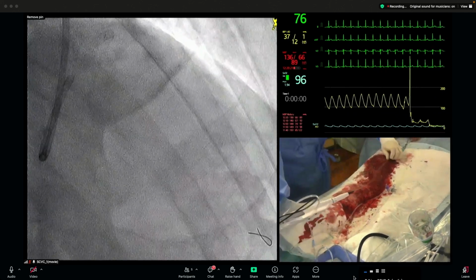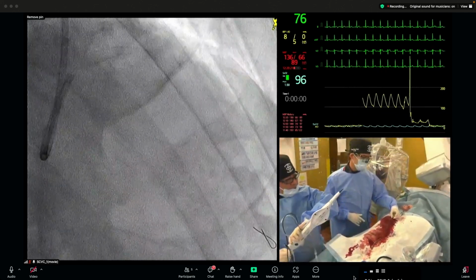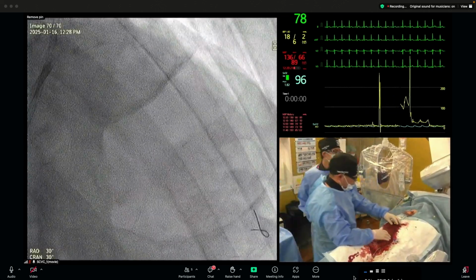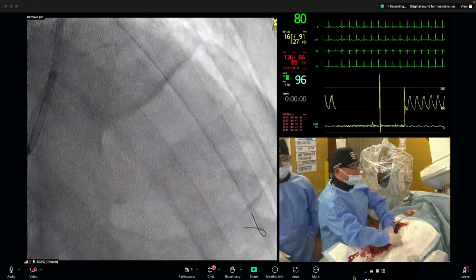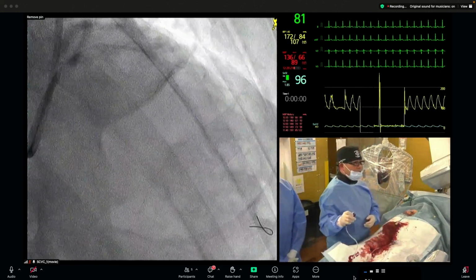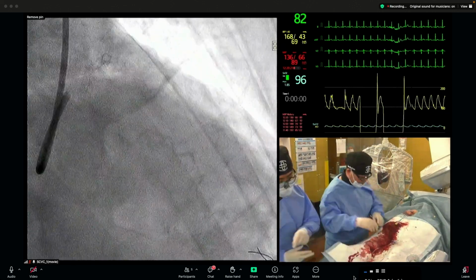I always use the distal radial approach with a 5 French or 6 French guiding catheter, so it's rather difficult to use a 1.75 burr or more. Just using modification and a cutting balloon may not be so difficult, compared to such a high-risk rotablation.